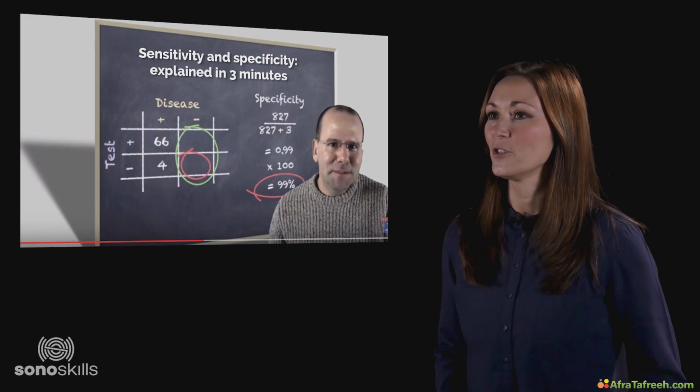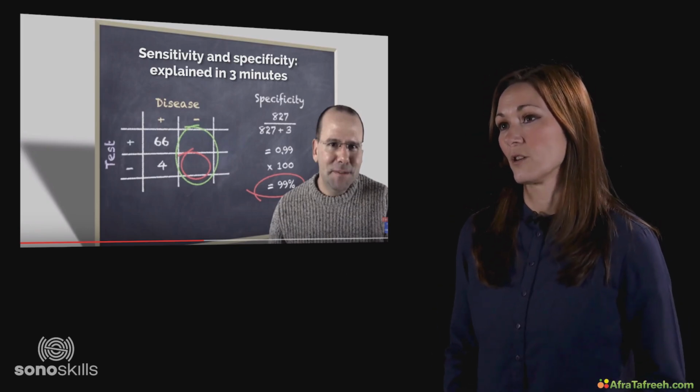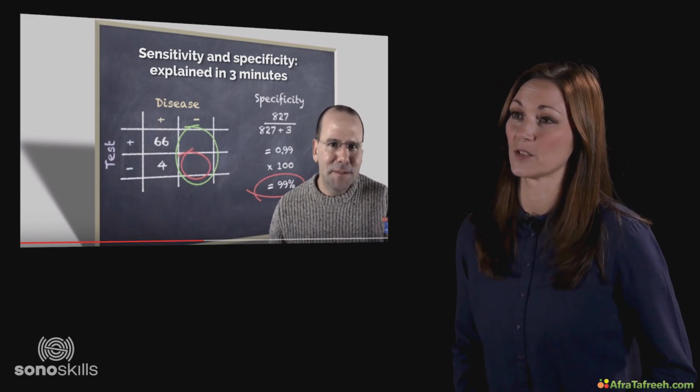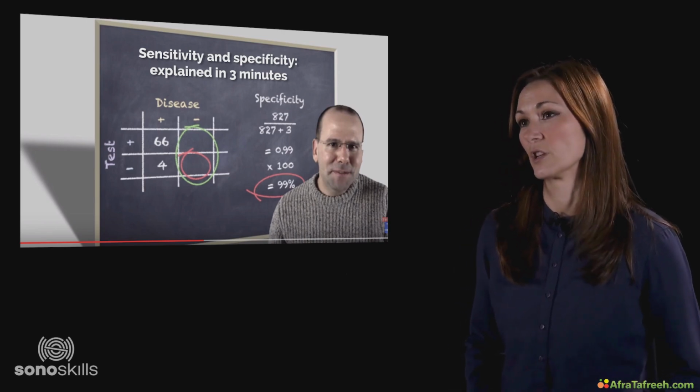Okay, so now you understand what the definitions of sensitivity and specificity are. You also know that ultrasound in general has a high diagnostic value, but that high value is dependent upon lots of clinically relevant influential factors which are very important for you to know.